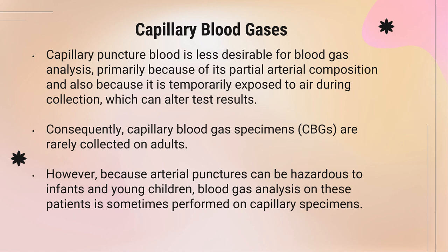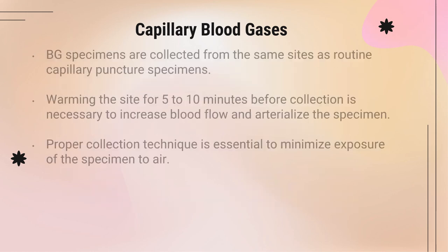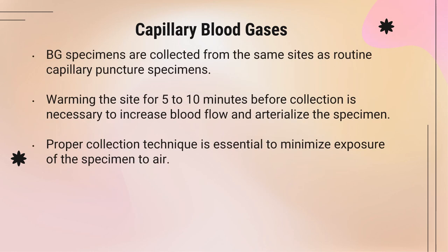Consequently, capillary blood gas specimens are rarely collected in adults. However, because arterial punctures can be hazardous to infants and young children, blood gas analysis on these patients is sometimes performed on capillary specimens. Okay, so blood gas specimens are collected from the same site as routine capillary puncture specimens. Warming the site using a warming device or a warm towel for 5 to 10 minutes before collection is necessary to increase blood flow and arterialize the specimen. Proper collection technique is essential to minimize exposure of the specimen to air.